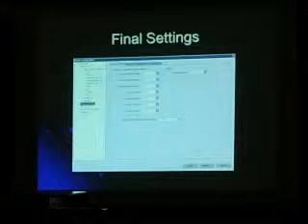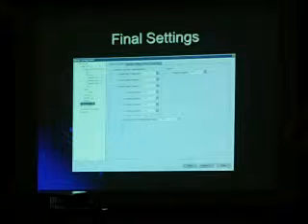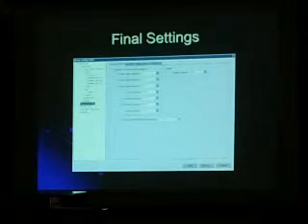When you set up the stim part, do you pre-program in all routine S1, S2s? Oh, no. I program what channel it's going to go on. That's all. That has nothing to do with your recording system. That's from your pacing, your pacemaking system.